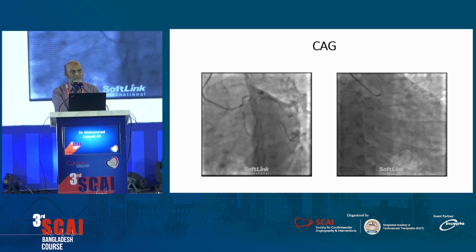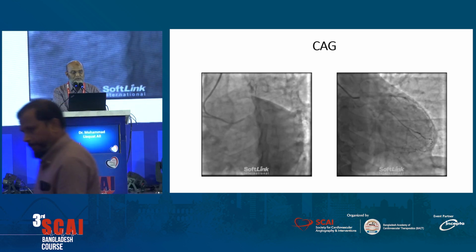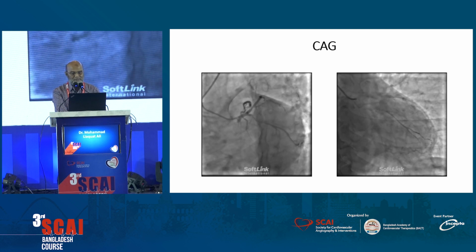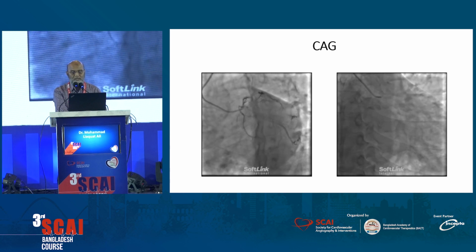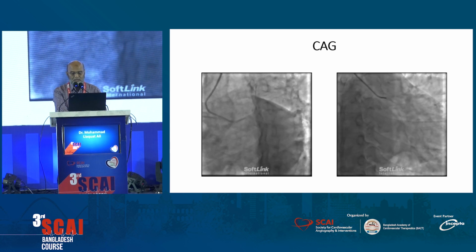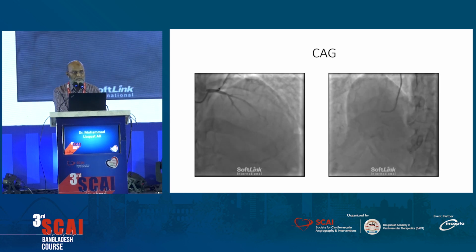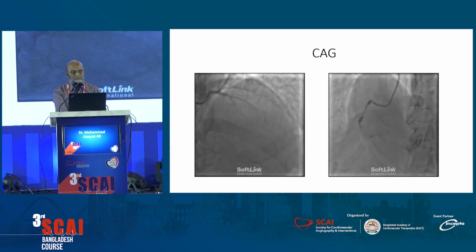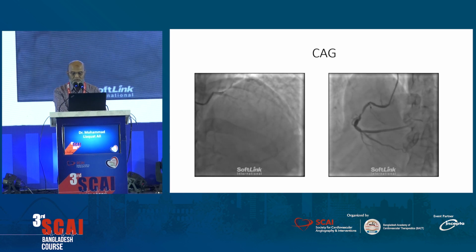So we were surprised to see the angiogram. You can see the LAD is tied very tight, approximately. And the diagonal looks to be fine. Also the LCX is tight, and OM1 is stenosed. In this view, we see that the LAD looks to be normal, but it is hidden by that diagonal. And the right one, RCA, also has a tight lesion.